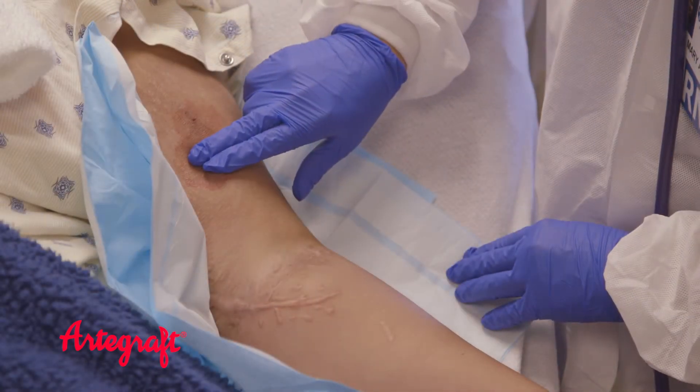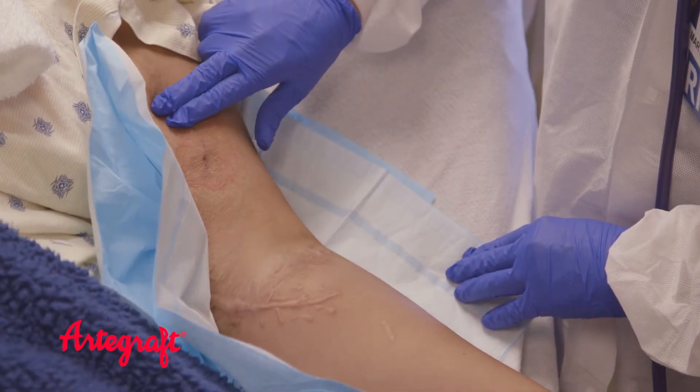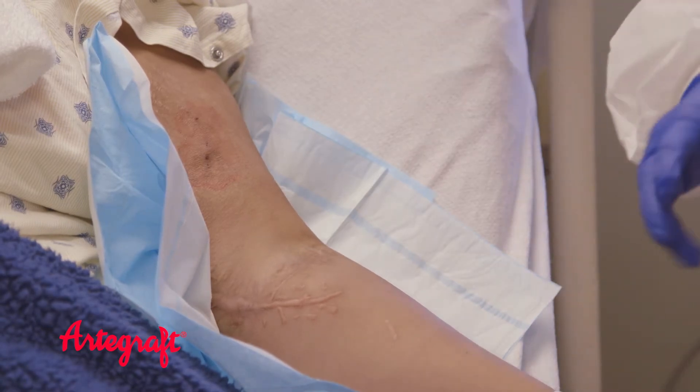Lastly, you feel for a normal purring and vibration — this is called the thrill. It would be abnormal to have no sensation or pulsation.